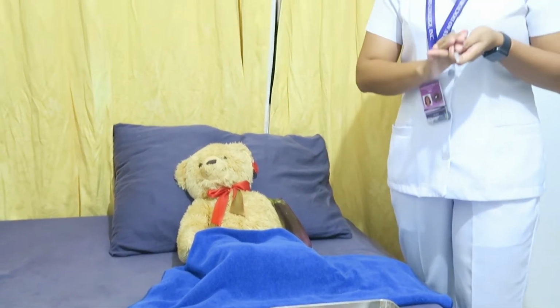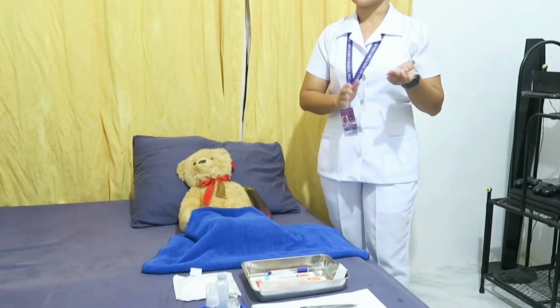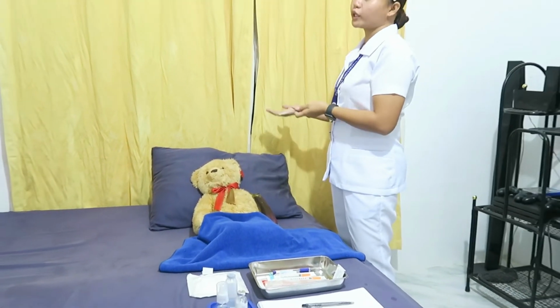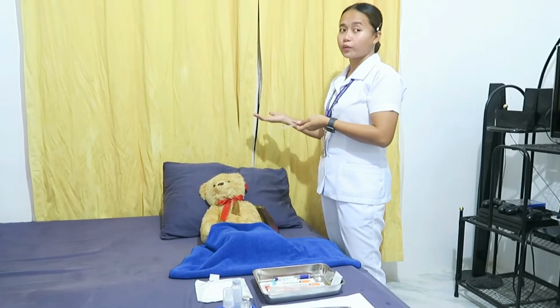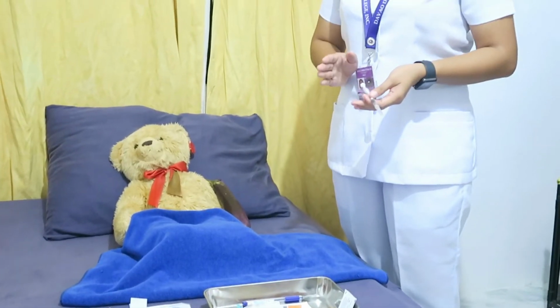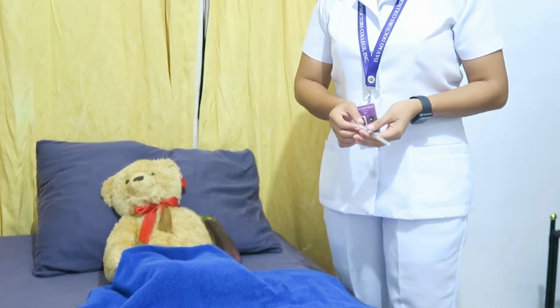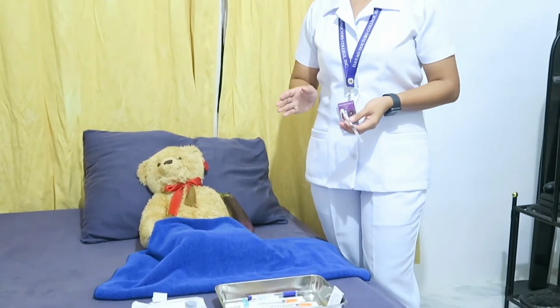The next procedure is to provide for the client's privacy. The rationale for this is to ensure the comfort and full cooperation of the patient. Since I've already closed the curtains or the window, and also the door, let's proceed to the next procedure. So the next procedure is to select and cleanse the site. The rationale for this is to prevent entry of microorganisms into the tissue.